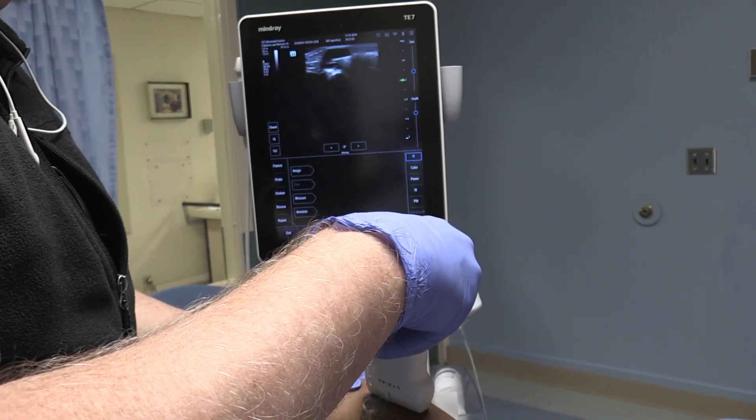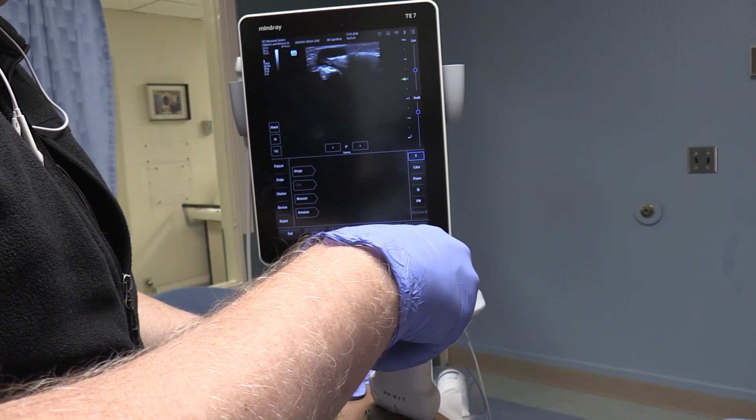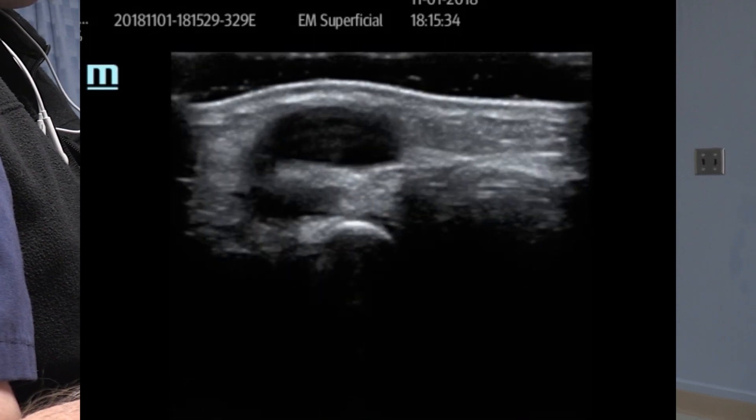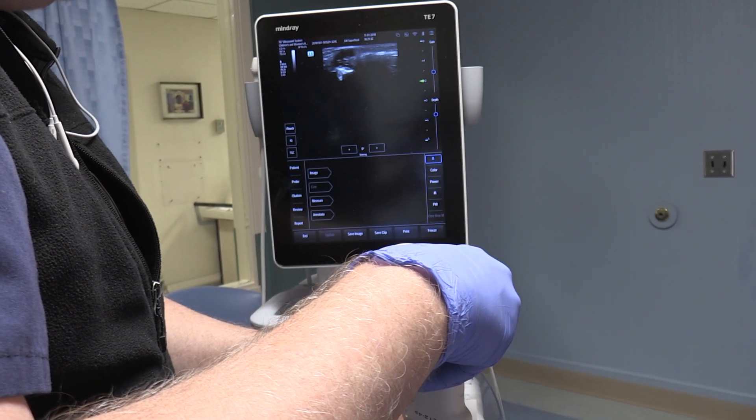We get that cyst, and coming right back over it — it hurts her a little bit — but what we're going to do is a needle aspiration on that. I'm actually going to do the ultrasound so you can watch the needle going in there.